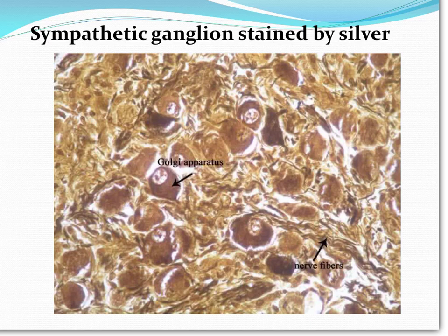Why is it sympathetic? Because the cells are uniform in size, they are scattered in the section, most of them show angulation, meaning they are angular. This means that they are multipolar. Also, they have uniform size. Almost all of them are of the same size. No marked difference can be seen between them.